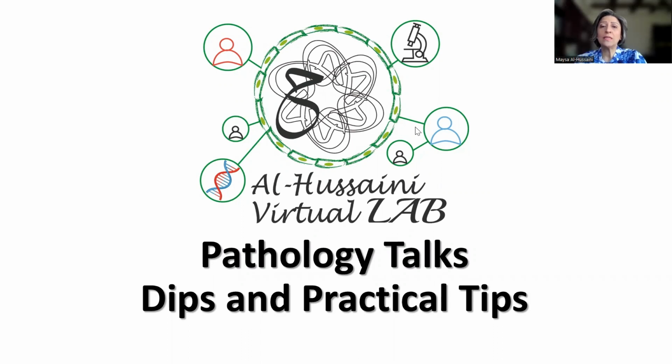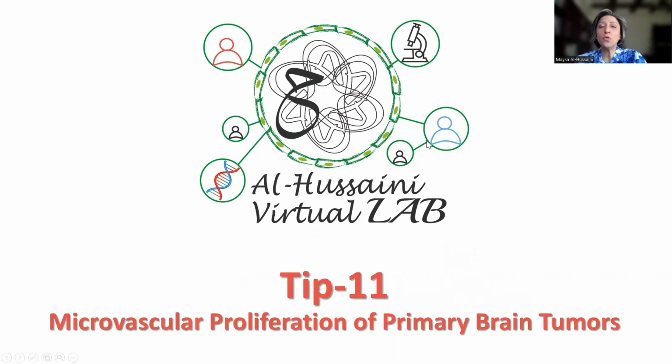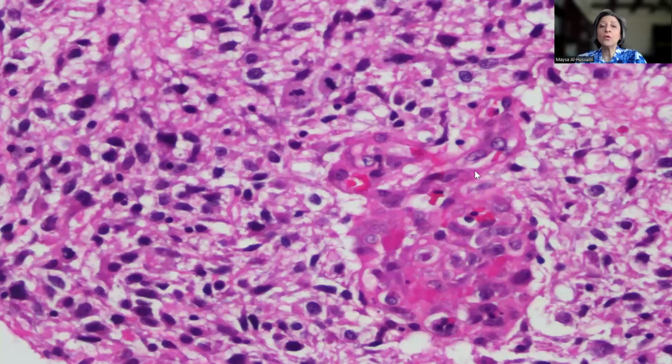Today, we're going to address yet another important tip, which is how to identify microvascular proliferation in the setting of primary brain tumors. And we know that microvascular proliferation resembles the appearance of a glomerulus. This is why we sometimes call it glomeruloid microvascular proliferation. However, it might not always be easy to identify.